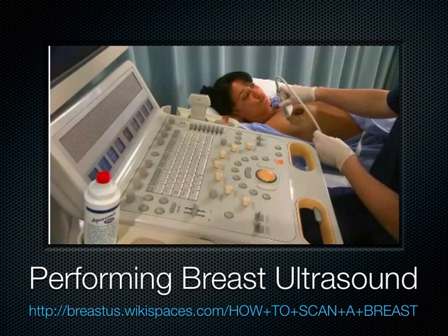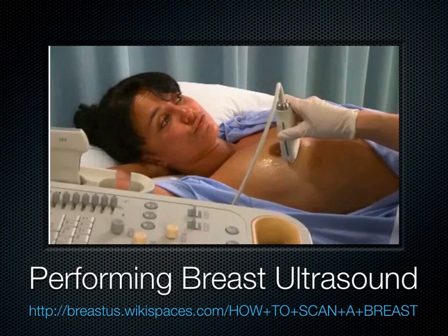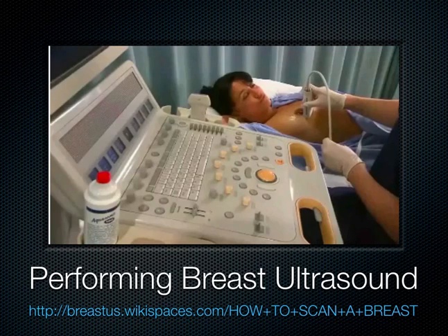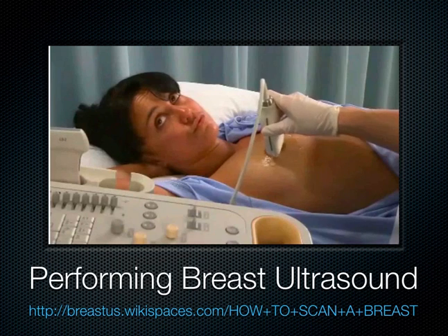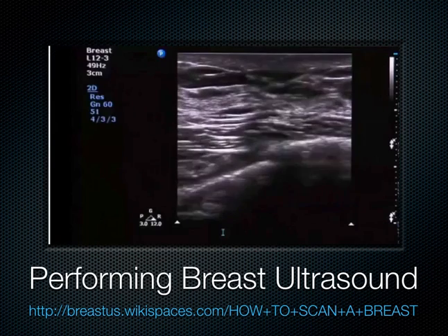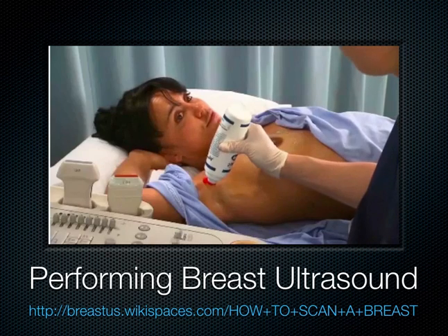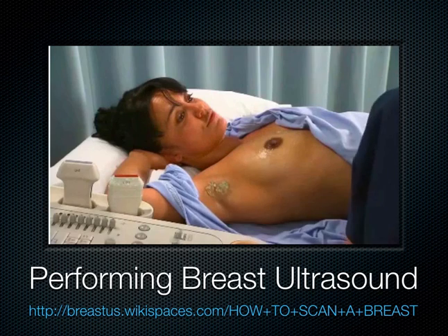Repeat the process for the transverse plane by sliding the transducer from the superior aspect of the areola over the nipple and just beyond the inferior aspect of the areola. Return to the middle of the nipple areola complex and obtain a representative image in the transverse plane. Apply gel to the right axilla.